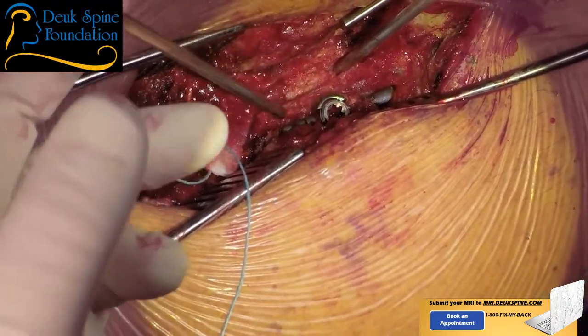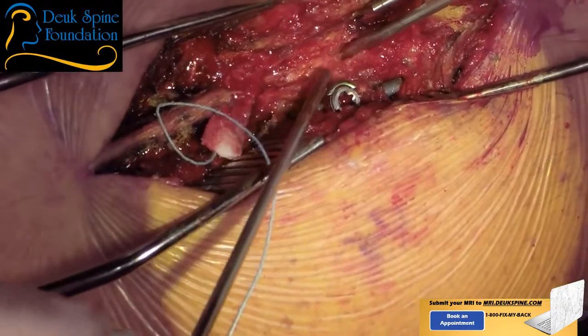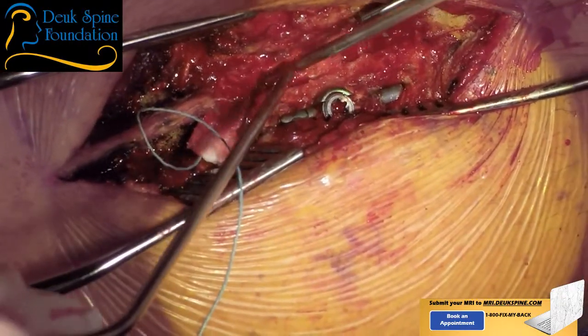Take suction. You may have a curette. Angled. Almost done.